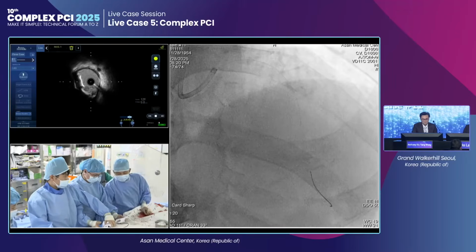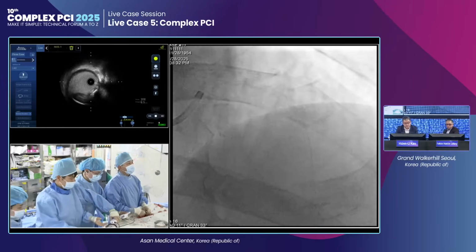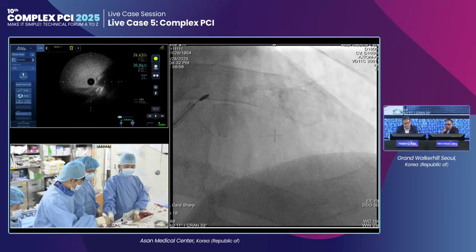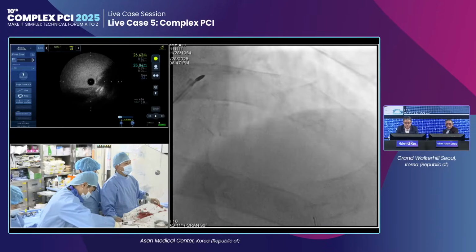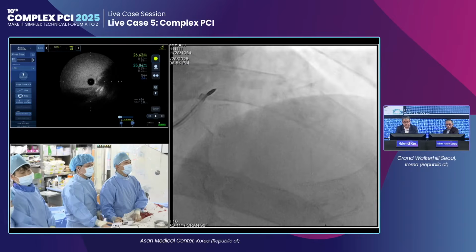To be very honest, given how much calcium there is in the distal left main and given the size of the distal left main, which is a relatively bigger lumen, I might be inclined to take orbital just because you can ablate the main also. Obviously, the alternative is to take a bigger burr or two separate burrs, in order to ablate the left main as well as the LAD.